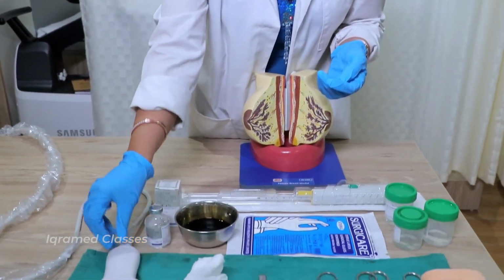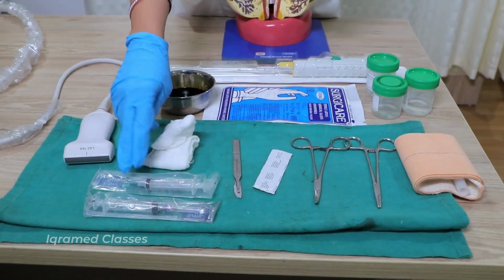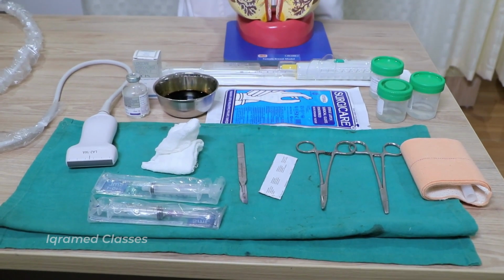Now, in case the fluid does not come and you have to make slides, then what do you do? Then it is always recommended to have the pathologist or the pathology technician make the slides, because one hand is busy with the ultrasound probe and with the other hand you cannot leave this and then make the slides. So you do the fine needle aspiration and you give it to the pathologist to make the slides, and you are done with the FNAC of the breast.